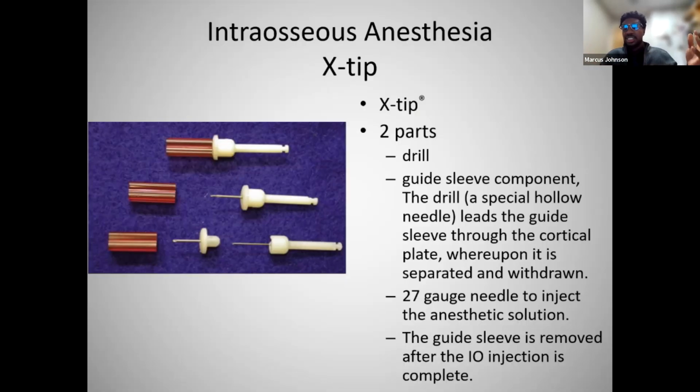So the intraosseous anesthesia, I happen to use the X-tip, and I'm just going to break that down for those of you who may or may not be familiar. I've seen that oftentimes when patients come in with a hot tooth, I've tried PDL, I've tried a mandibular block, they were on NSAIDs prior to the visit, you name it, we tried it, but this has really been a significant shift in my practice in terms of getting profound anesthesia in a consistent manner.